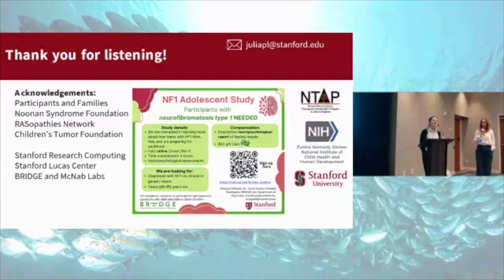Yeah, so this study was focused only on the cortex and the gray matter because the T1, T2 ratio seems to be more valid in the gray matter than for white matter. However, we did use a different approach and look at the white matter using another MRI technique, quantitative T1 mapping, which actually indicated greater myelination in kids with RASopathies in the white matter.